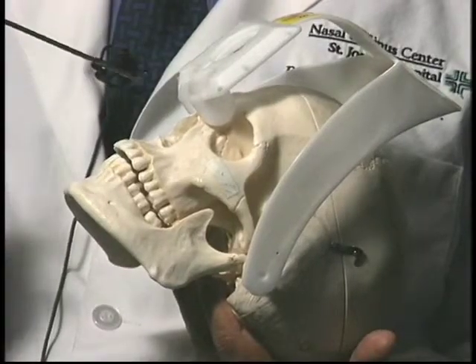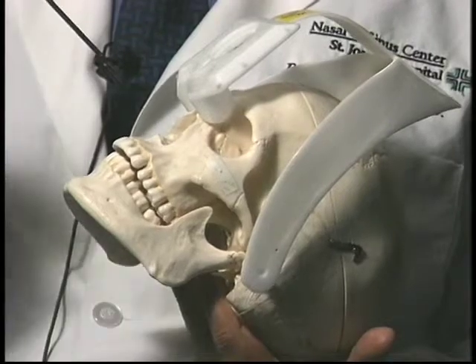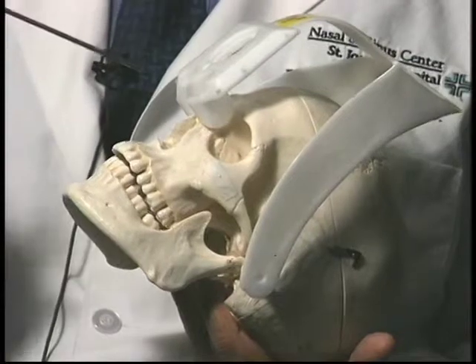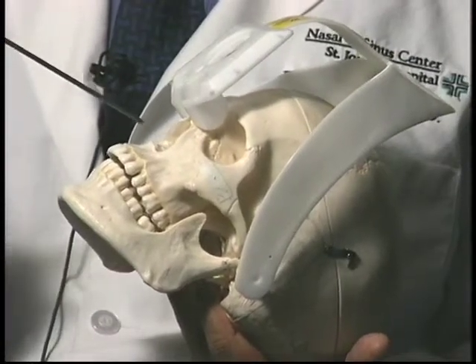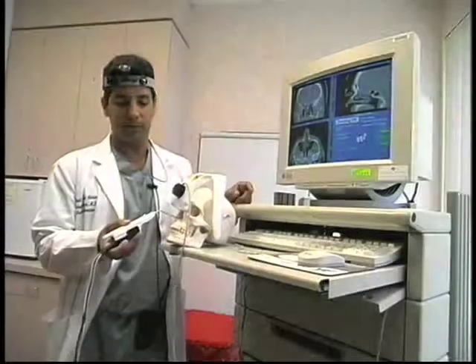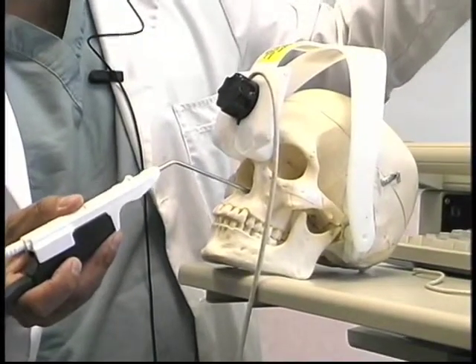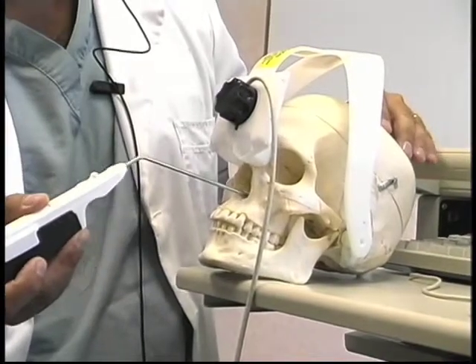At the time of surgery, we're able to introduce this probe, and the probe is able to allow us to visualize on the CAT scan our exact point in the nasal cavity. What's very special about this is that the tool is not used to tell us how to do the surgery. It's a verification device. So if I'm going to enter into a sinus, then I'll go to the opening and say, there's the opening, and I'll use this tool to verify where I think I am. If it doesn't match, then we have a problem. And that adds a huge higher level of safety for the patient.